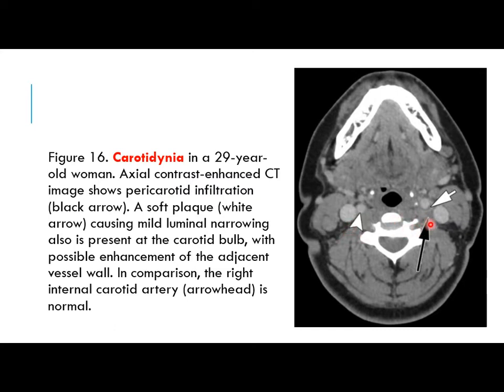And comparing to the right side, we can see this is a normal carotid. The other one there is a space. Here? Yes. Oh, it's missing. Yes. This is known as carotidynia.